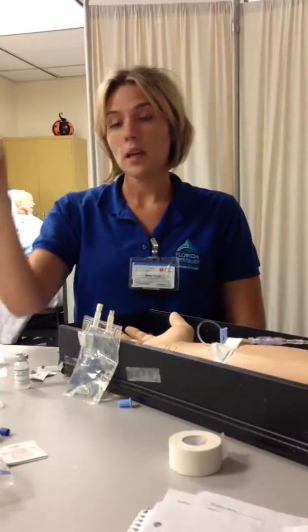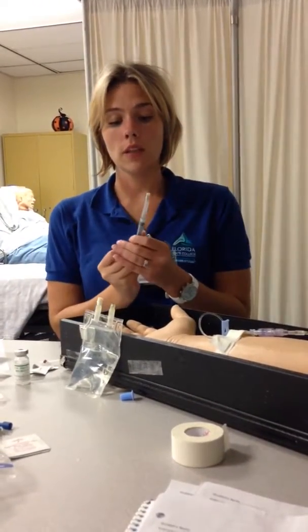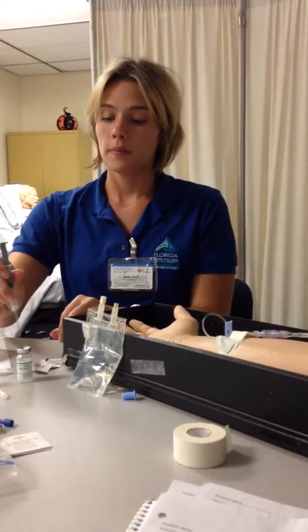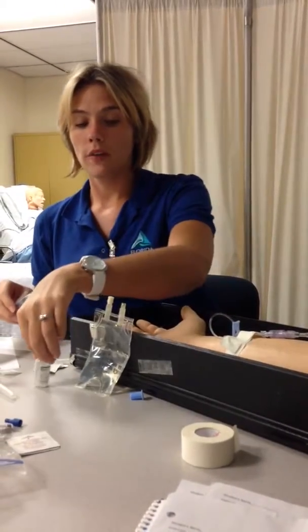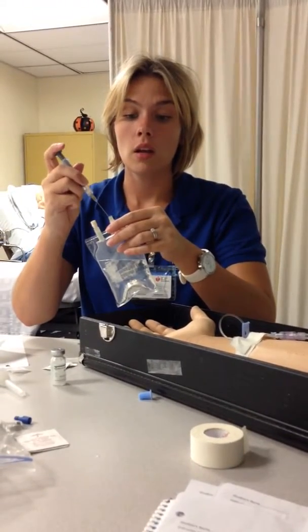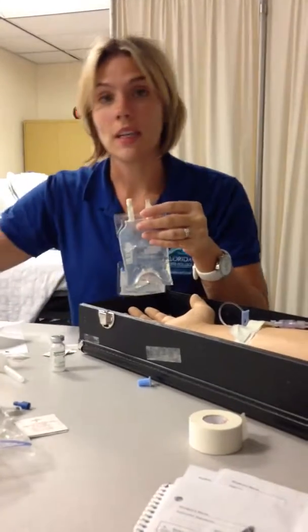So what I'll do is I am going to clean my Flagyl vial. I'm going to take my syringe and pull back my 2 mLs. It's been cleaned. Pull back 2 mLs. Perfect. Now this is sterile. I just removed the cap. I'm going to inject 2 mLs, and then I'm going to put this syringe in the sharps container.